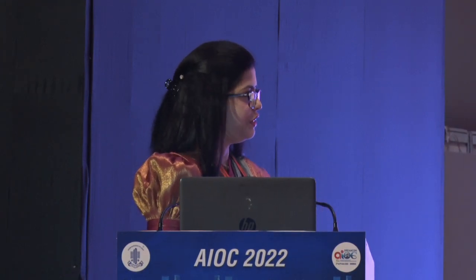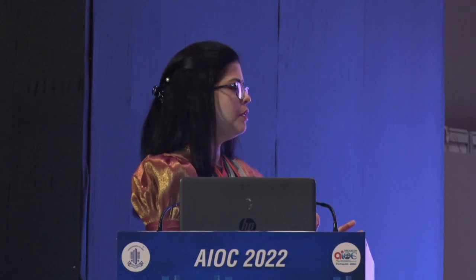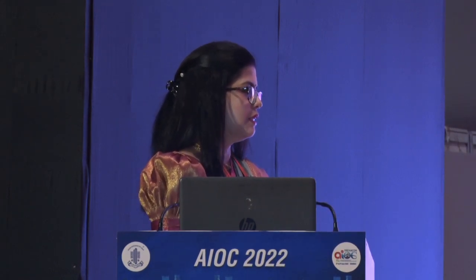I could not show the video because this is a poster presentation, but you keep milking the fluid out, and at the end of about 10 minutes or so, all the fluid usually comes out and we can attach.